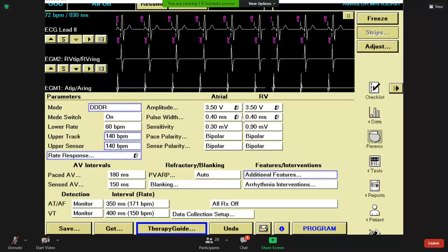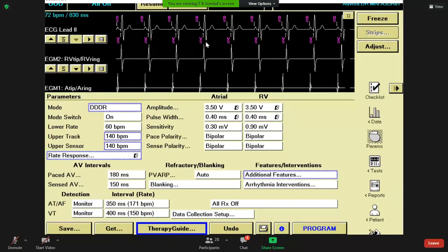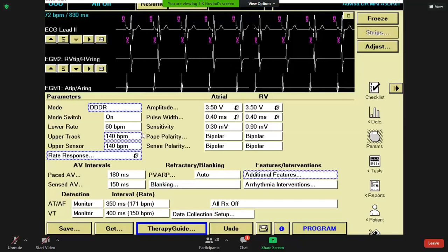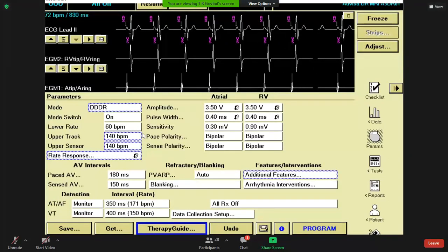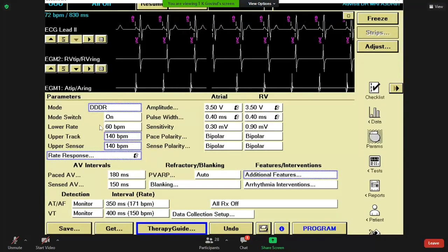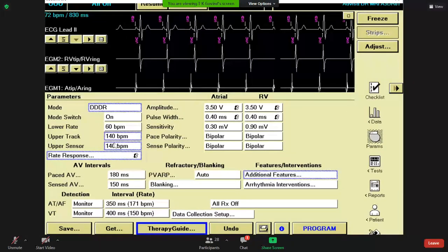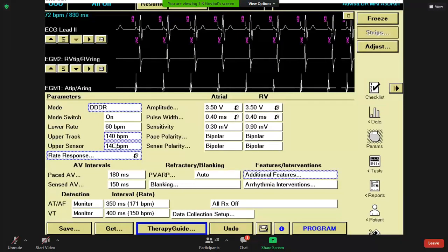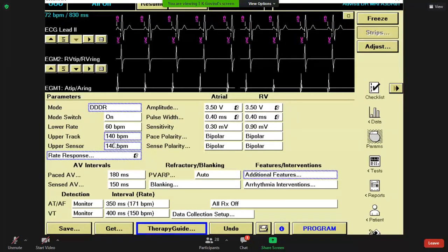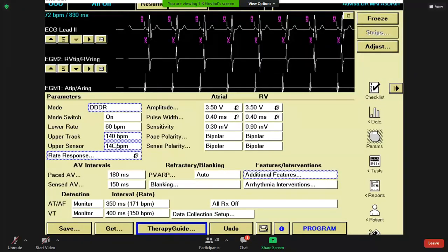Right. So in that situation, then there will be DDIR pacing. So the ventricle will be paced at a sensor indicated rate. So the patient should not feel seriously symptomatic. I would believe if the patient still is feeling symptomatic, it was because of a change in the AV synchrony status of that patient, and he should become all right in the next few minutes.